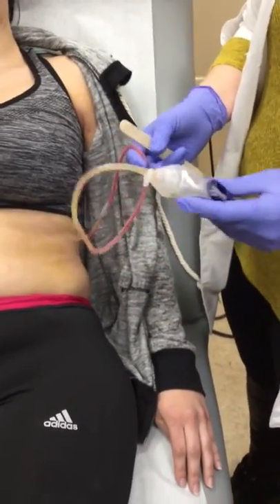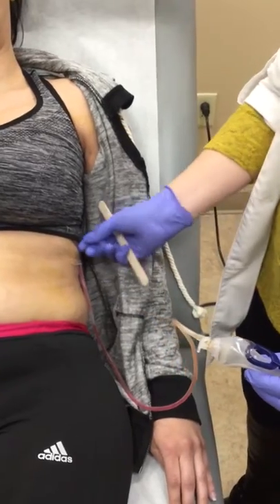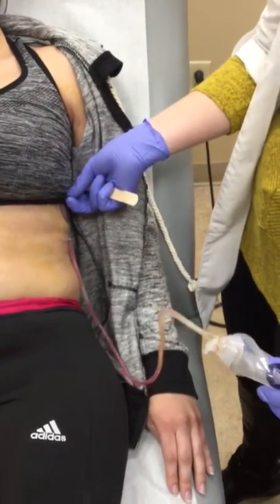Today we're going to learn how to strip a JP drain, or Jackson Pratt drain. You want to be very careful because sometimes these are not sutured in — they're only taped in.